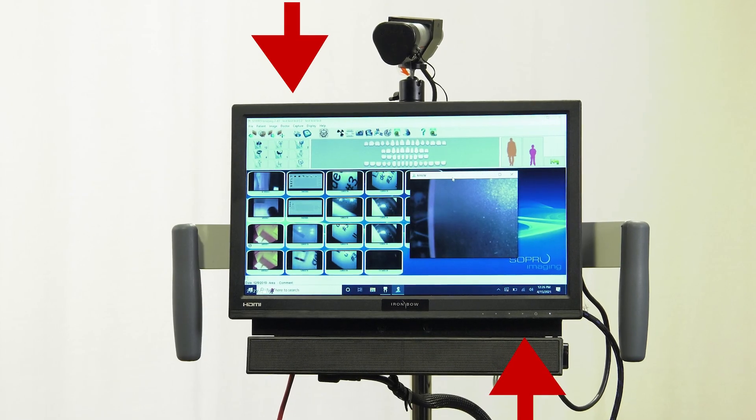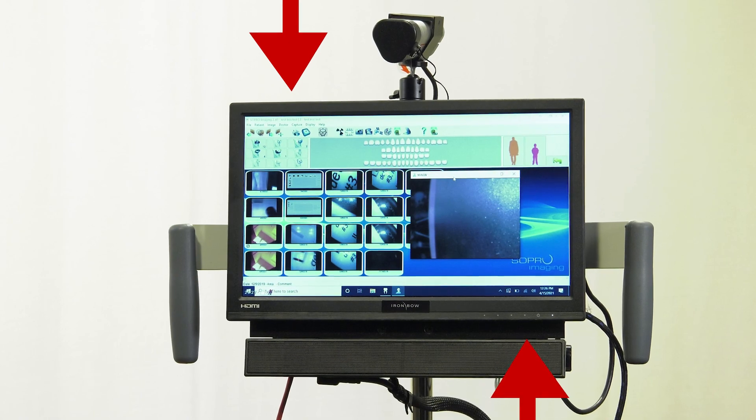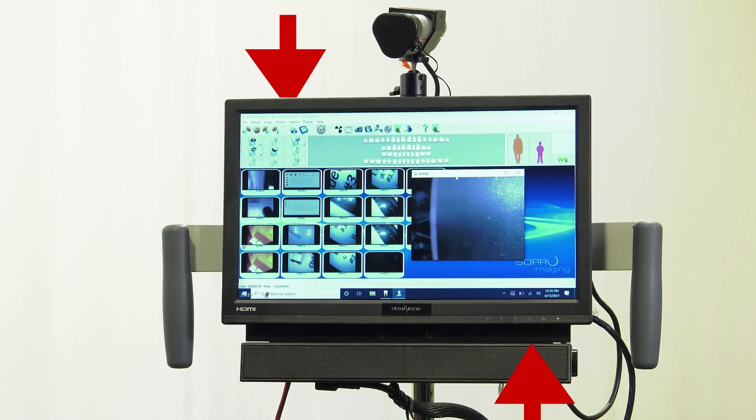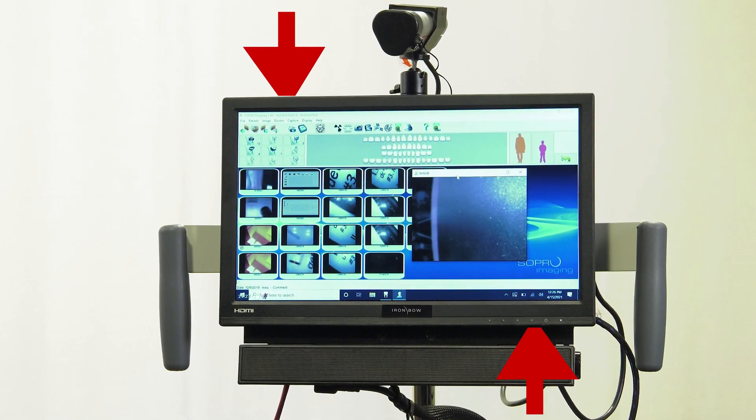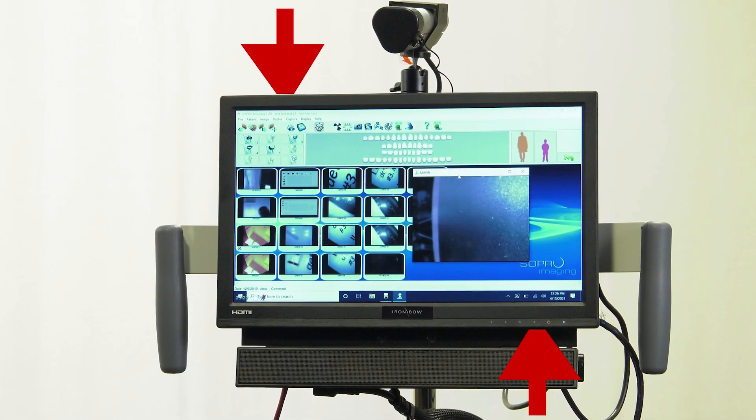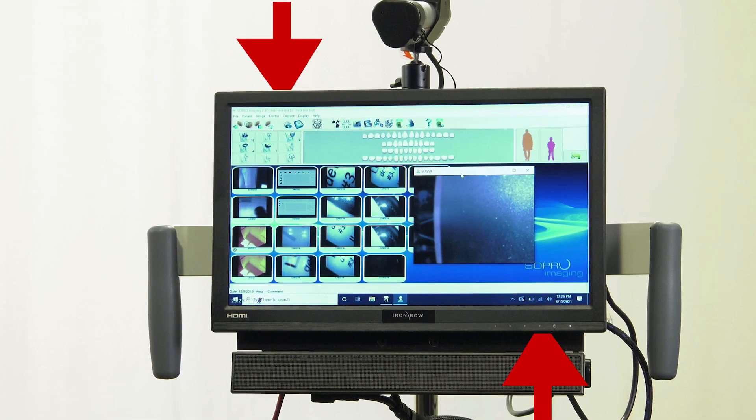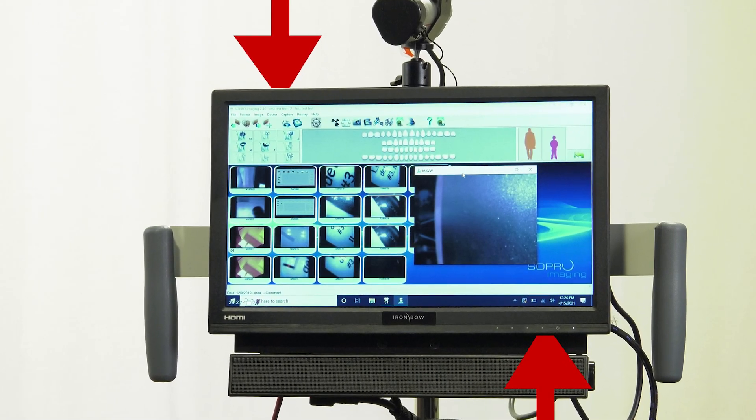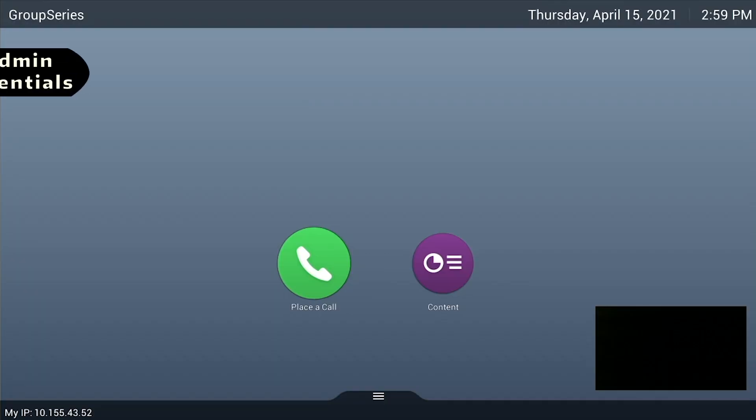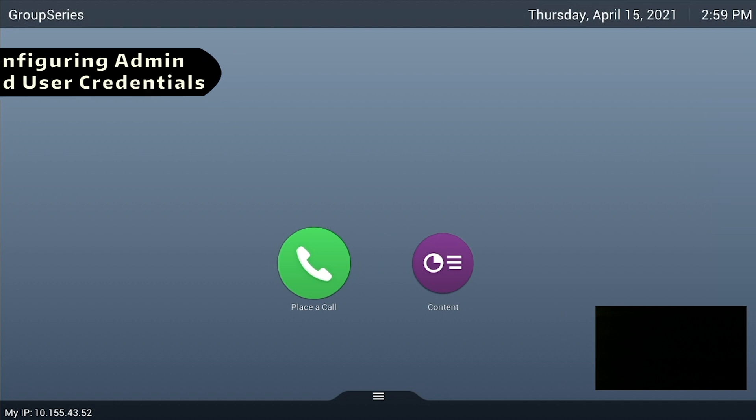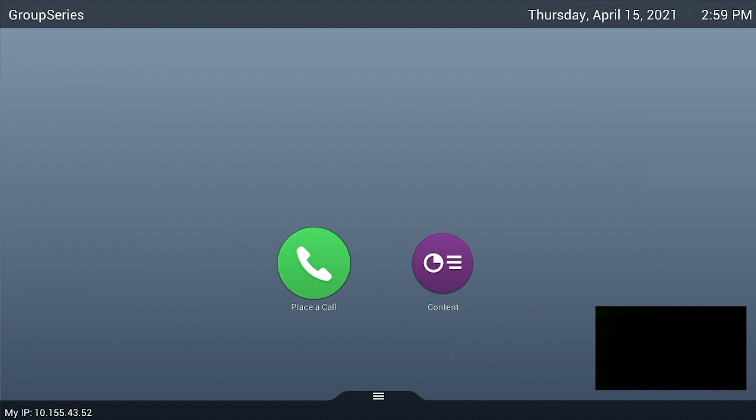For the cart, there are two power buttons: one on the top left of the unit and another on the bottom right, under the screen of the Polycom unit. To configure the cart and enable security features, admin and user credentials will need to be set on the Polycom Video Codec device.